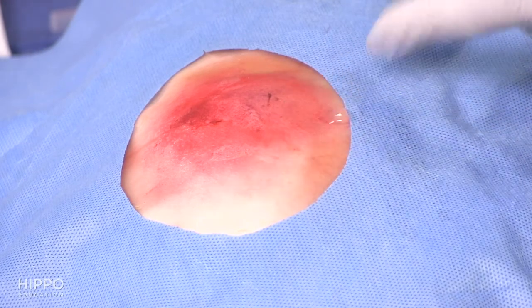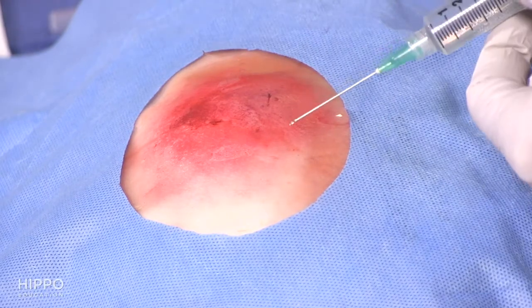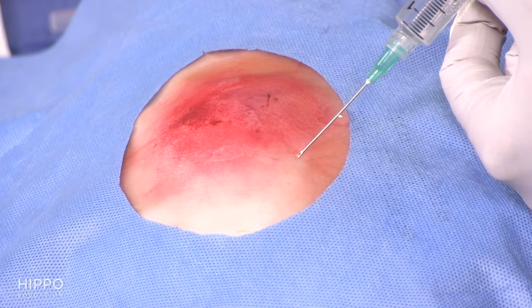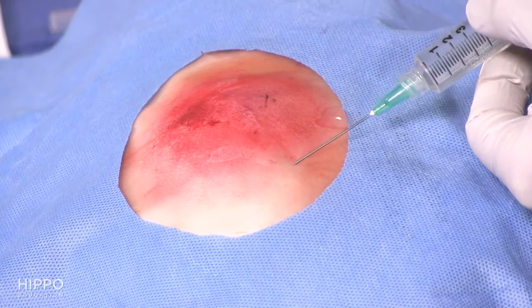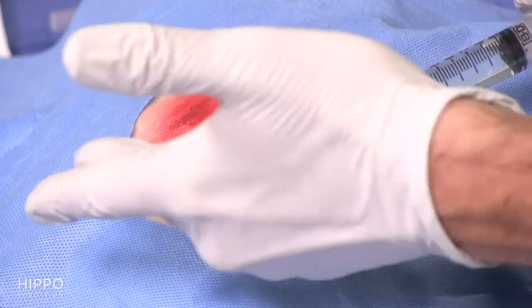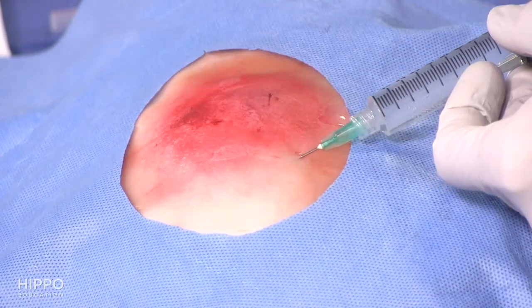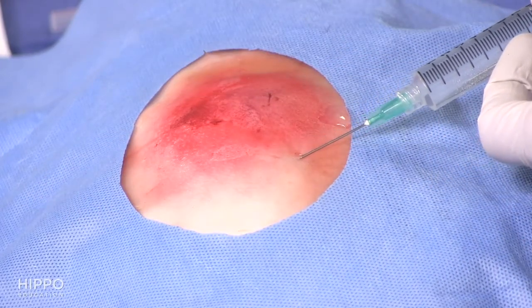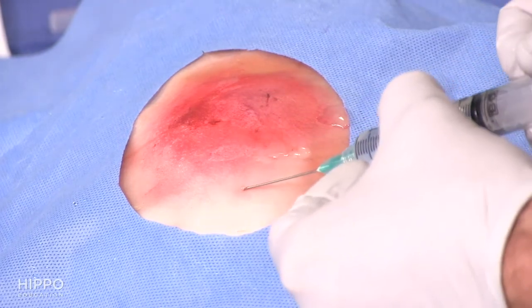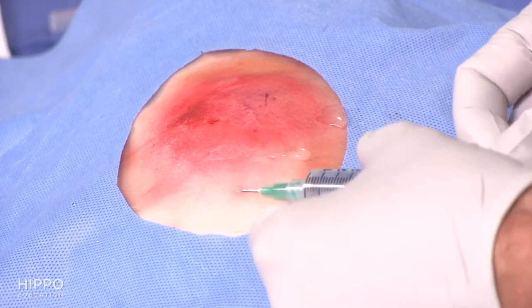So now you have this area anesthetized, and it's nice. You've got to keep moving, but you always want to put your needle in an area that's already been anesthetized so that they do not feel the pain of the cutaneous puncture. That's really the part that hurts, the puncture part. So now going in this direction and infiltrating after aspirating. And you basically continue that till you have gone completely around the area.